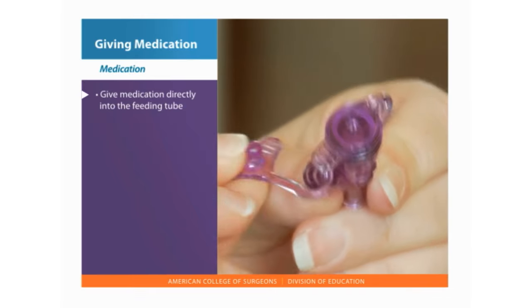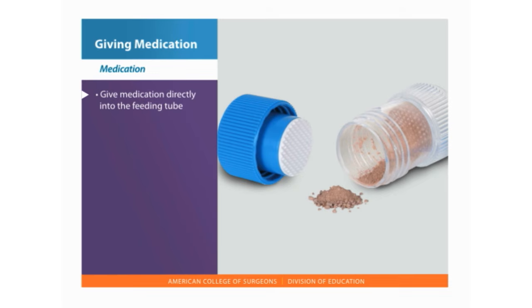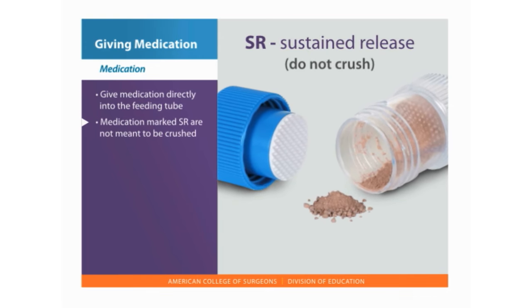Give medications directly into the feeding tube. Never add them to the feeding bag or mix medications with the tube feeding formula, breast milk, or with each other. A liquid medication is easiest, otherwise your pills will have to be crushed using a pill crusher. Some medication, marked SR for sustained release, are not meant to be crushed.